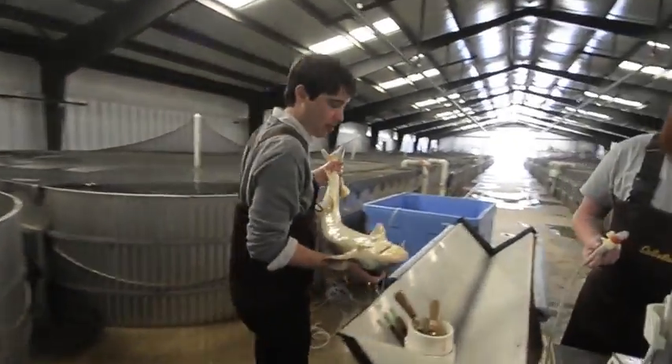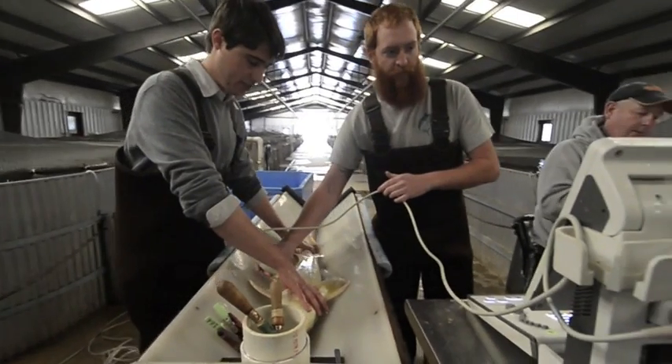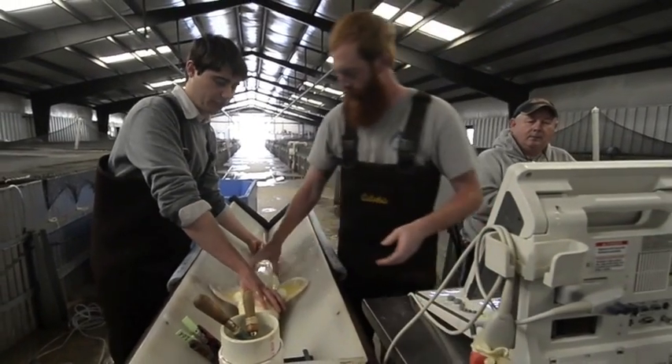We take the fish and we put them up here on this top to ultrasound them. This fish weighs about 6 kilograms. Mason's looking at the image to determine if the eggs are of a good enough size for us to take a sample.